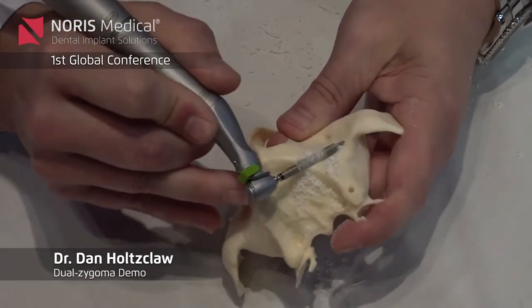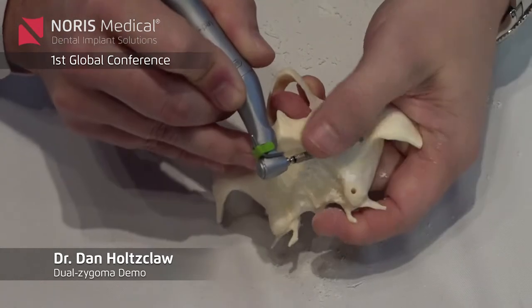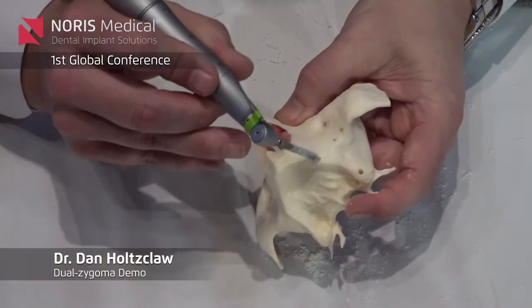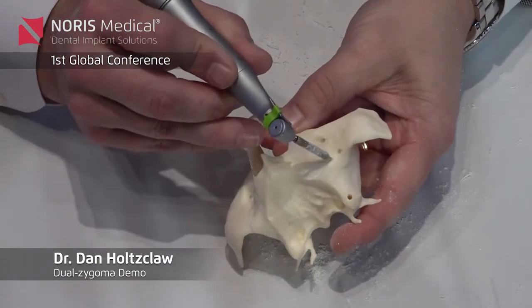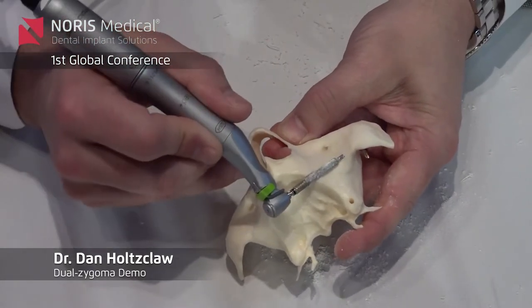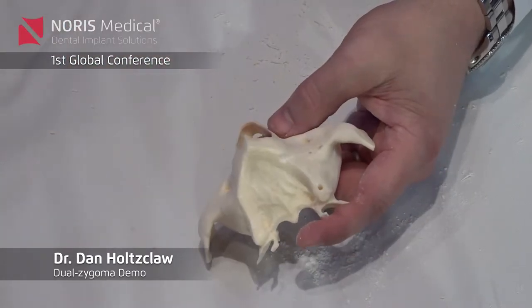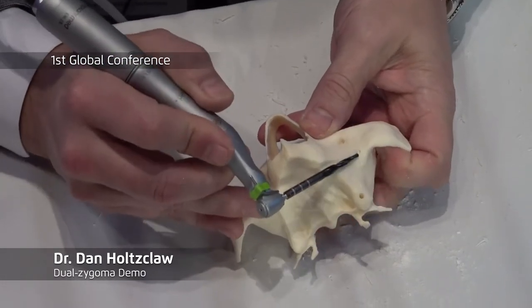Now, how deep I want to get this into the bone — this is how much of the implant will be out of the bone. You can see I'm starting to get this channel, and this channel will now guide all of the other drills. I can go in with the next drill and this will essentially guide me.